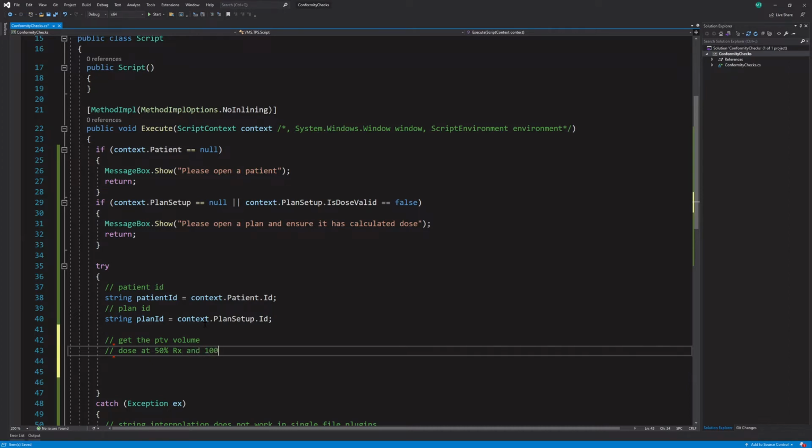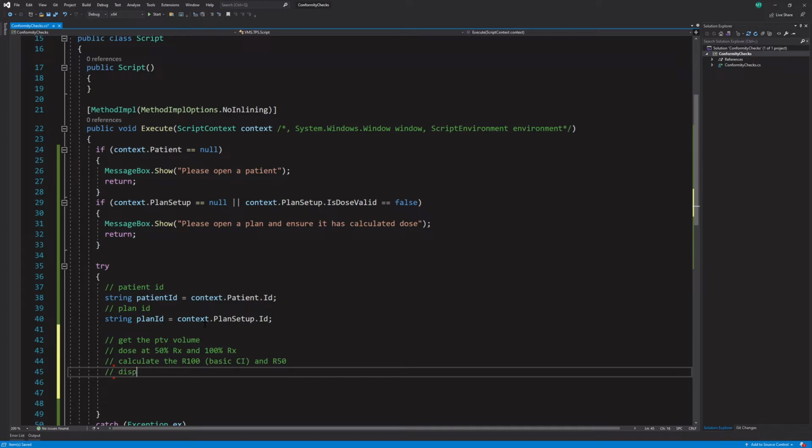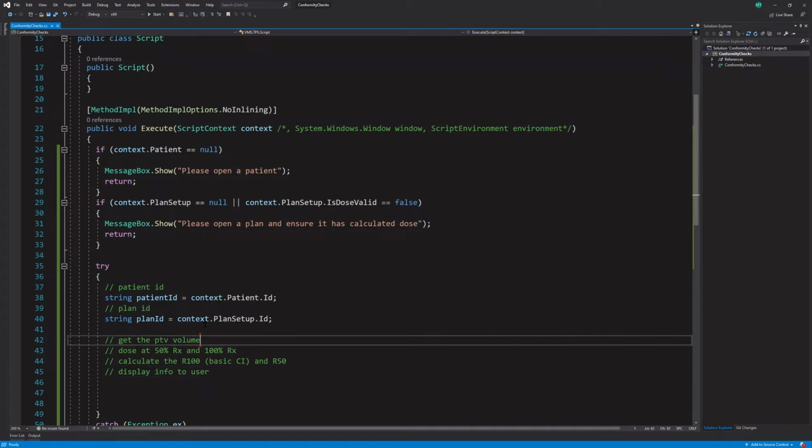And 100% RX. And then we need to calculate the R100, which is the CI, like a basic CI, and R50. If you were reading this in a paper, you'd see a capital R. R50. And then we need to display info to the user.